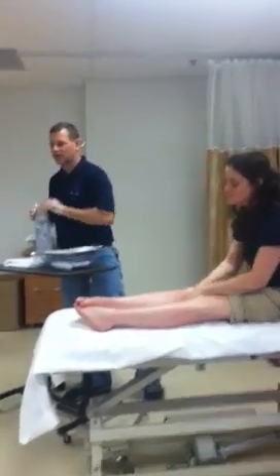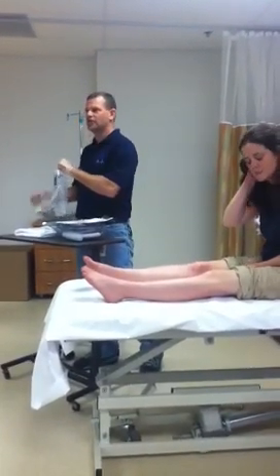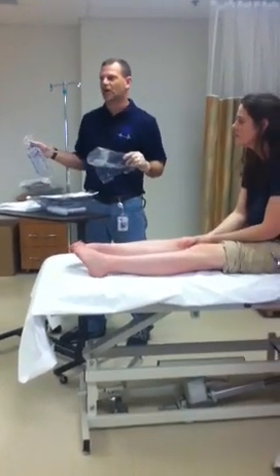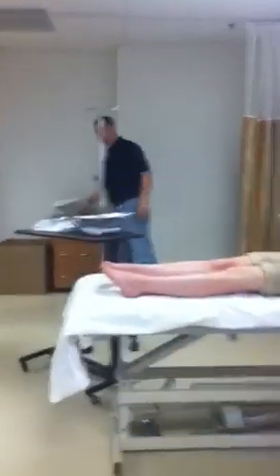Saline solution — I can use water, clean water, but they recommend usually saline. The book actually recommends that you put this in a warm water bath so that it's close to your body temperature. I've never known if you want to do that, but that doesn't mean it's not a good idea.